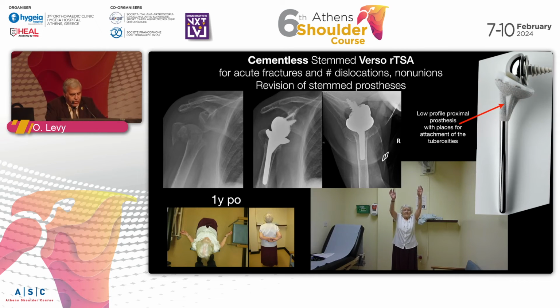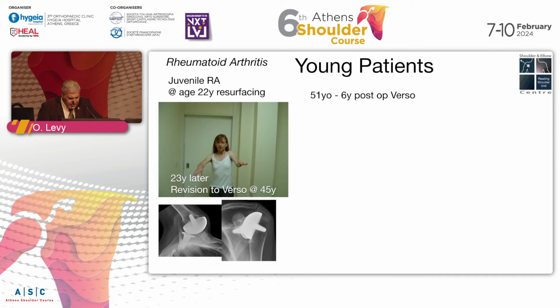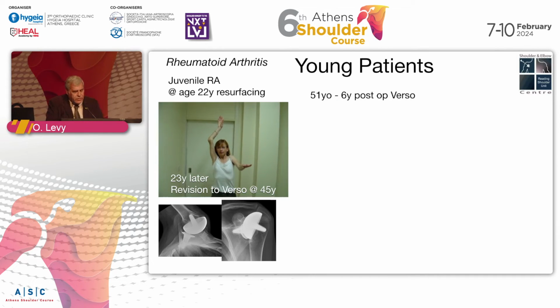And there's a stemmed implant as well, and we use it for fractures. This is made for fractures for cementless fixation. And you can see, actually, this is now I would say the first line to use in elderly patients with comminuted fractures. Now, young patients. We talked about young patients.